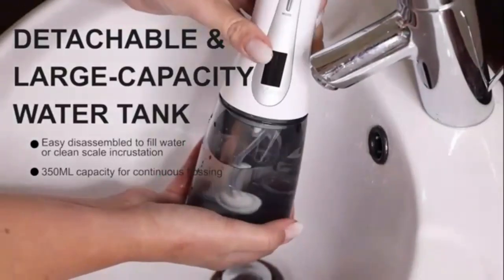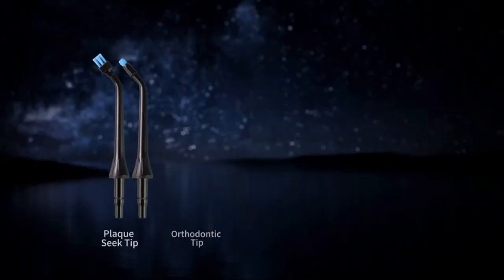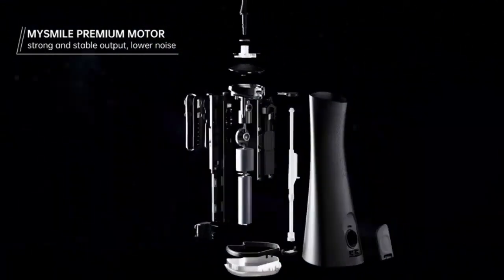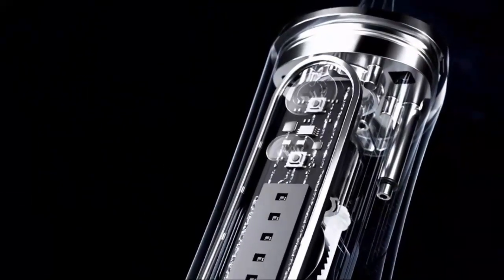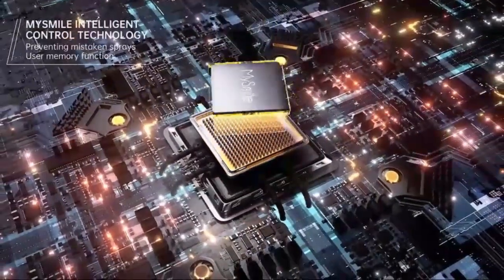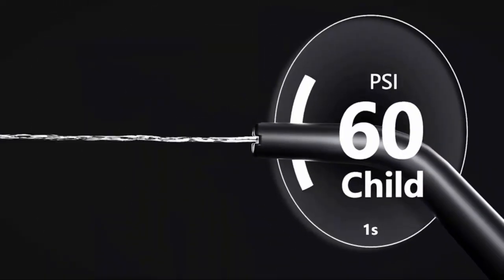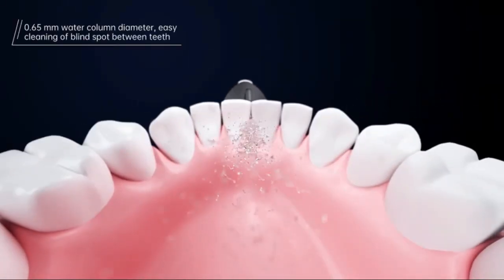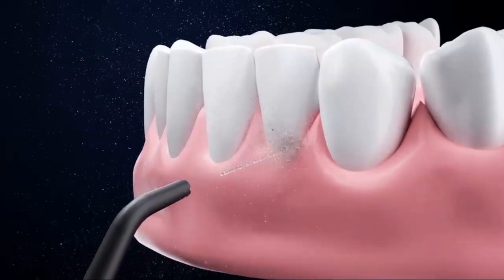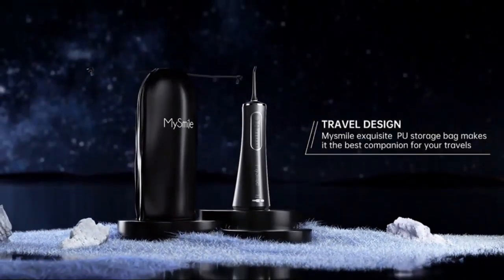Upgrade your dental care routine with MySmile for healthier gums and a brighter smile. Experience professional-level dental care at home with the Water Dental Flosser, featuring an impressive 1,000ml large capacity for uninterrupted teeth cleaning sessions. Its powerful water jet reaches deep between teeth, effectively removing plaque and debris where traditional brushing can't. The built-in UV storage compartment sterilizes flossing tips, ensuring a hygienic experience every time. With multiple pressure settings, it's perfect for sensitive gums and those with braces or implants. The ergonomic design makes it easy to handle, and its quiet operation ensures a comfortable, stress-free experience. Achieve cleaner, healthier teeth in minutes.